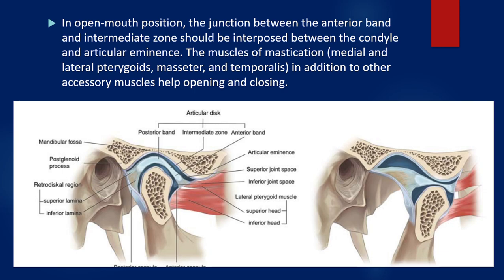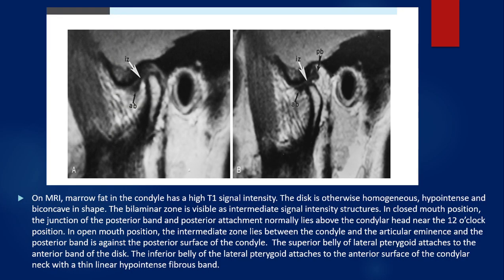If normal positioning is not present, as seen in the picture on the right, there is disruption of the joint with displacement and dislocation. On MRI, the marrow fat in the condyle has a T1 high signal. The disc is otherwise homogeneously hypointense and biconcave. The bilamellar zone is visible as an intermediate signal zone. In a closed mouth position, the junction of the posterior band and posterior attachment lies above the condyle at approximately the 12 o'clock position. In an open mouth position, it lies between the condyle and the articular eminence, with the posterior band against the posterior surface of the condyle. The superior belly of the lateral pterygoid attaches to the anterior band of the disc, while the inferior belly attaches to the anterior surface of the condyle neck via a thin linear hypointense fibrous band.